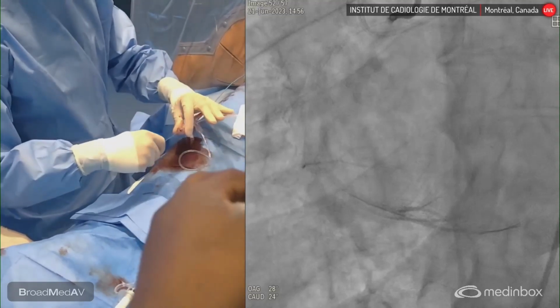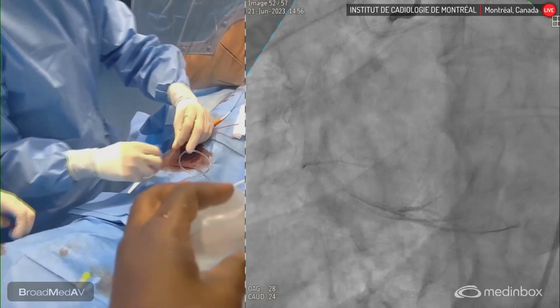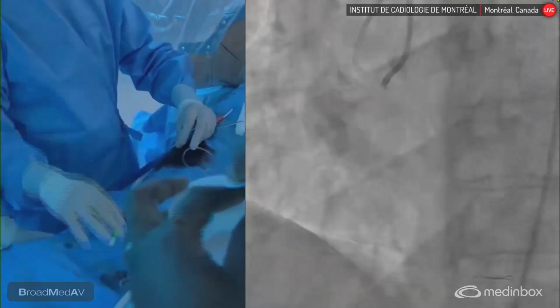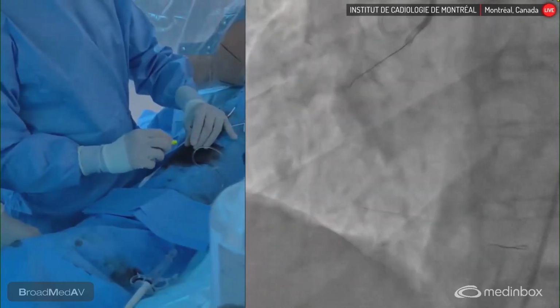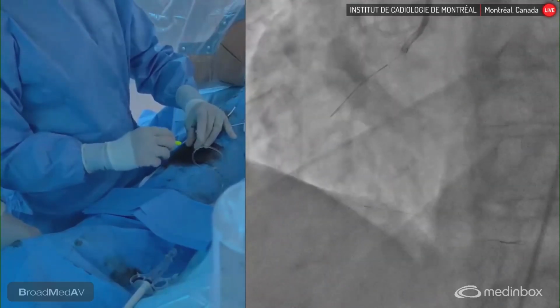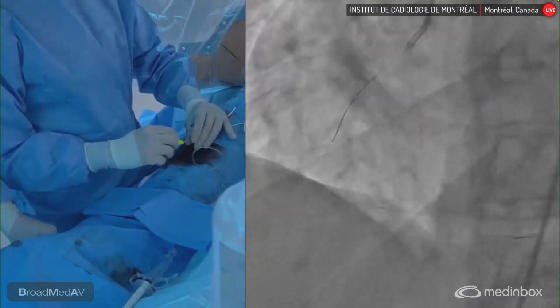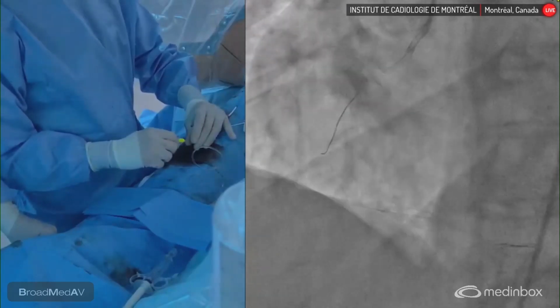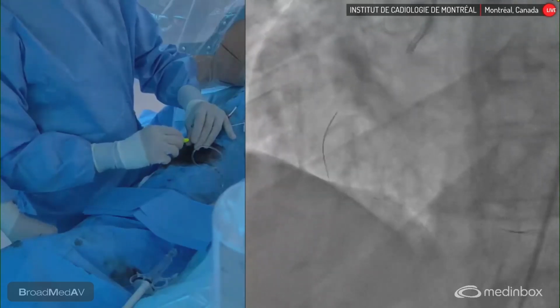So for sure, the workhorse needs to navigate the proximal plaque. It's well open, the vessel. Should be okay, but we'll see. If ever there's issues, we can always use a dual lumen catheter. But it's very important to use a workhorse wire here and keep it moving. You cannot force it down. With workhorse wires, I've already had, if you knuckle them in such anatomy, you can still get into the subintimal space and it can cause issues. There you go, that's smooth.